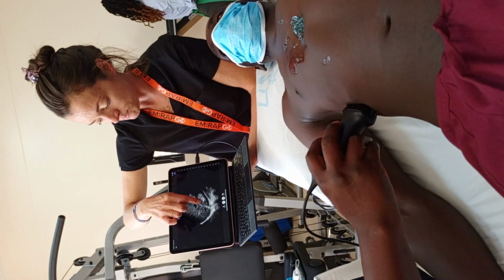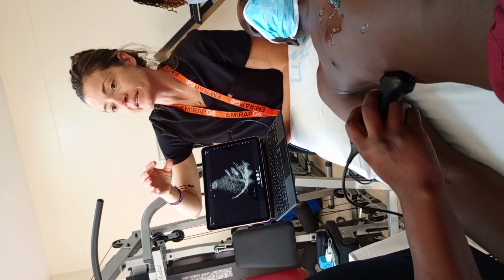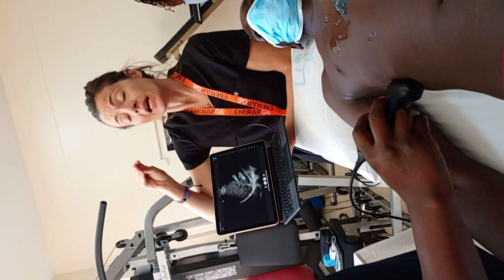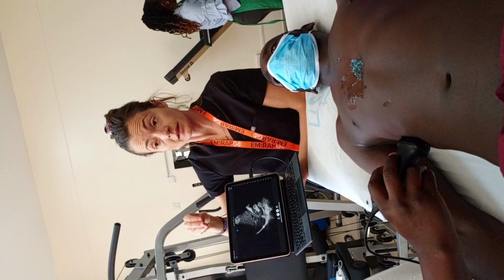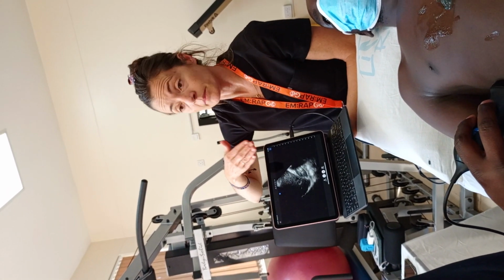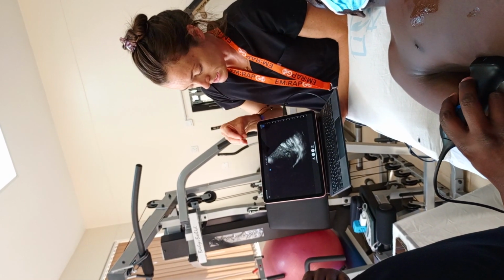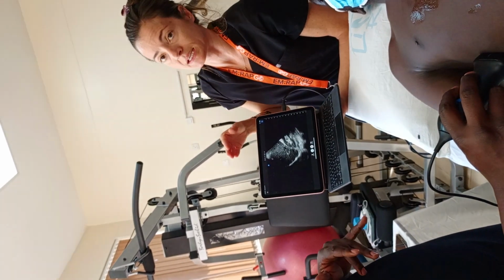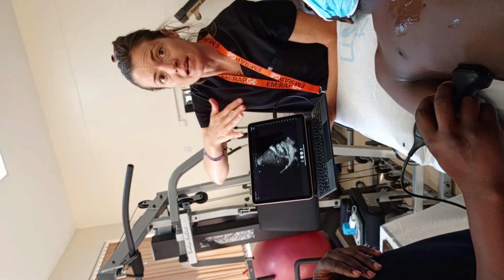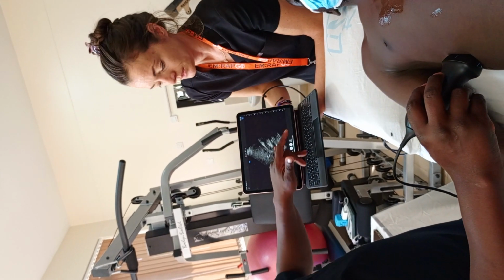So this space, see that bright white line between the kidney and the liver? We call it Morrison's pouch. That's a potential space, right? In a normal healthy person, there should be nothing there. We should just see a nice bright white stripe. If he was a trauma patient, hit by a car and internally bleeding, I would see black space separating the liver and the kidney. And that would be a positive FAST. That would be blood that's in the abdomen, that's collecting in that space. Okay?